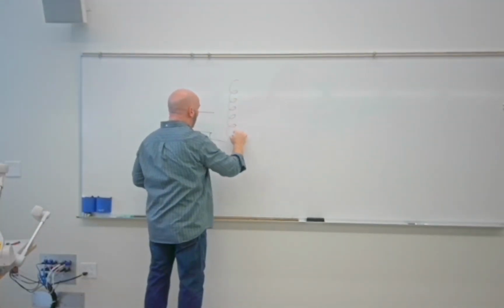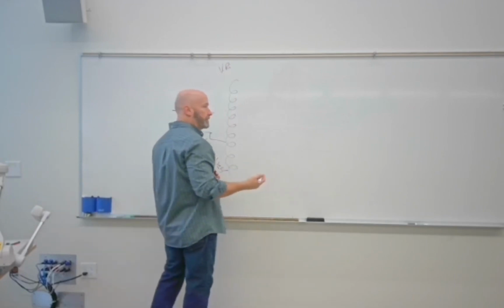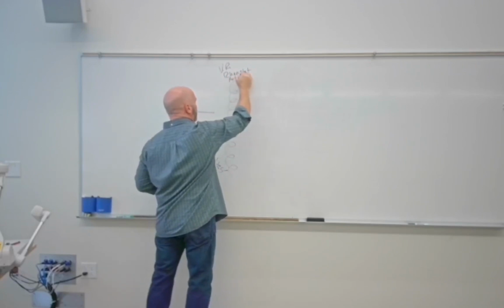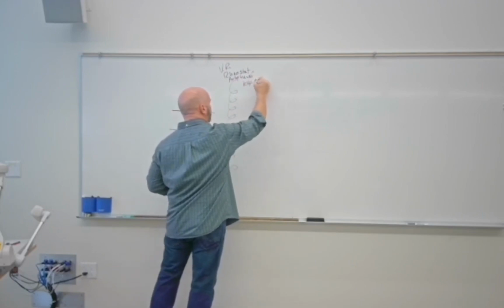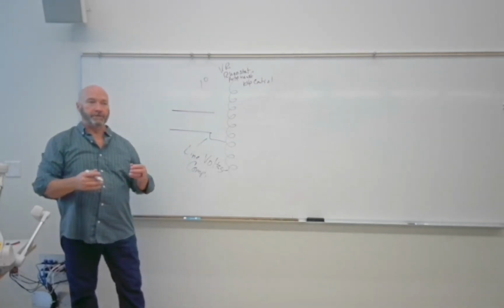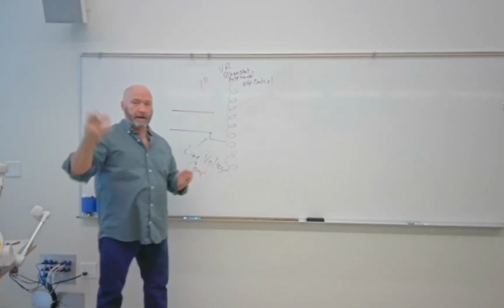So the autotransformer, all the words we used for it before, that would be the variable resistor, right? Variable resistor, what other words do we use? Rheostat. It is, again, the autotransformer. And it is also our kVp control. So our turns on the primary side are set. When we adjust our kVp, what we're actually doing is adjusting the contacts on the secondary side. We squeeze them together and we get a lower voltage. We spread them apart, we get a higher voltage.